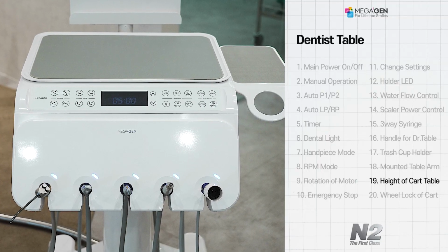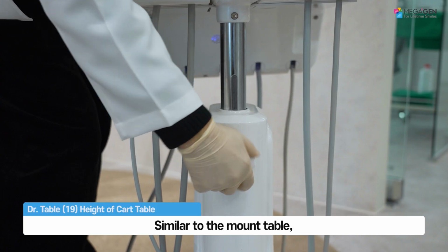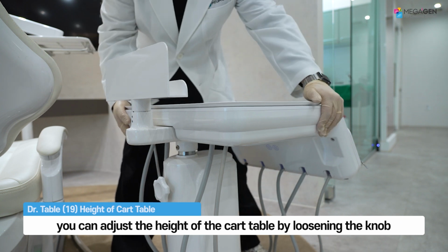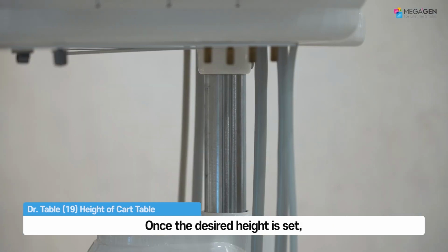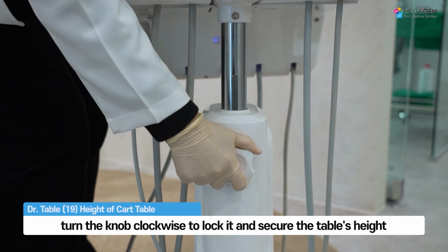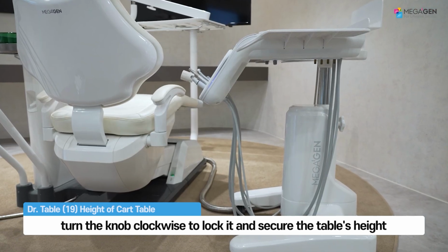Cart table height adjustment. Similar to the mount table, you can adjust the height of the cart table by loosening the knob. Once the desired height is set, turn the knob clockwise to lock it and secure the table's height.